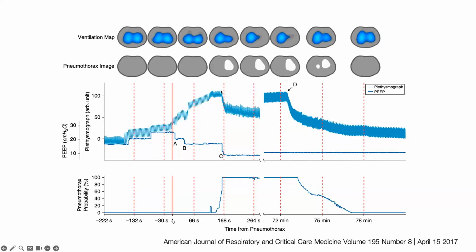And what this phenomenon suggests is that every breath is not being exhaled. We are keeping some air inside of the chest cavity. So we are producing a pocket of air inside the pleural space, that is the pneumothorax. And as you can see, we have almost one part of the lung with reduced ventilation distribution, and these white pixels are the detection of pneumothorax.